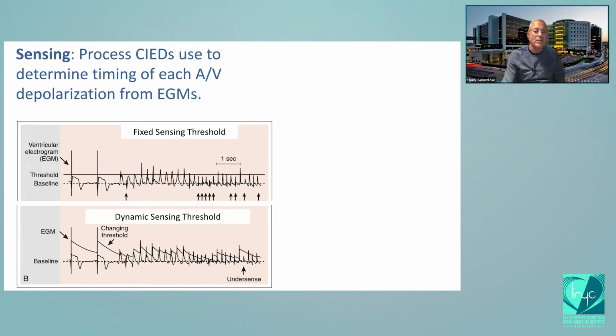Okay, enough on capacitors. I want to turn now to the process of sensing. So Pierre and Mark and Sylvain and I have spent a lot of time thinking about sensing. And you may have heard a little about sensing in your pacemaker lecture. I'm pretty sure you did. But just to review a few things, sensing is the process defibrillators use to determine the timing of each cardiac electrical signal.